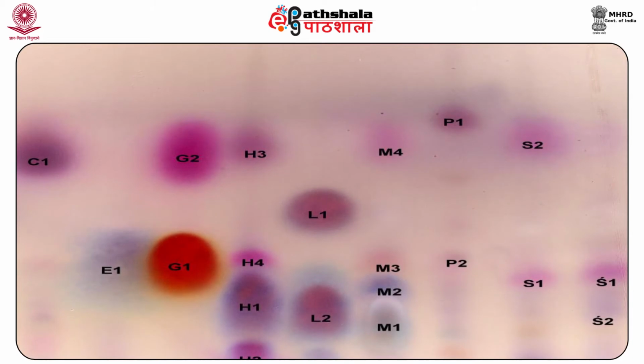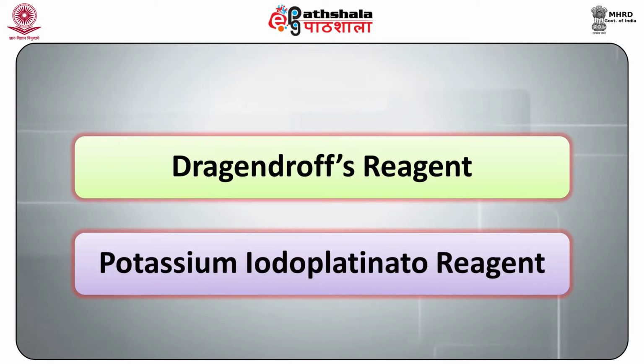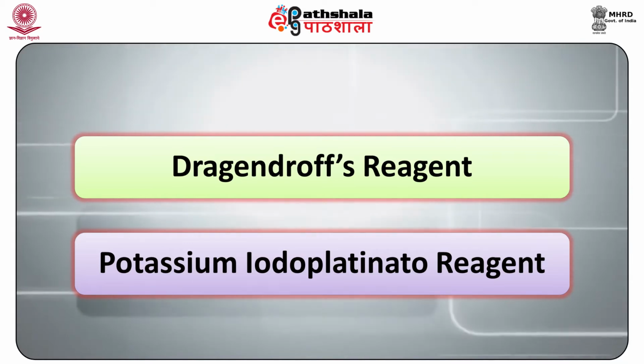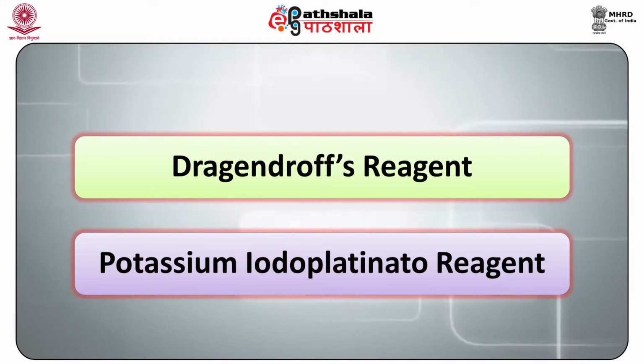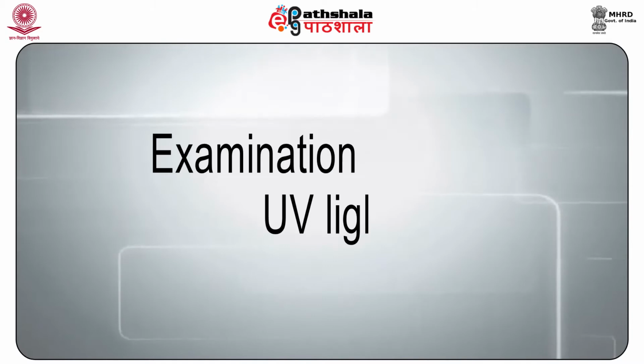by this method. There are 2 types of reagent used in TLC method. They are Dragendorff reagent and potassium iodoplatinate reagent. Basically, TLC works on the principle of separation according to their affinity towards the relative phases.